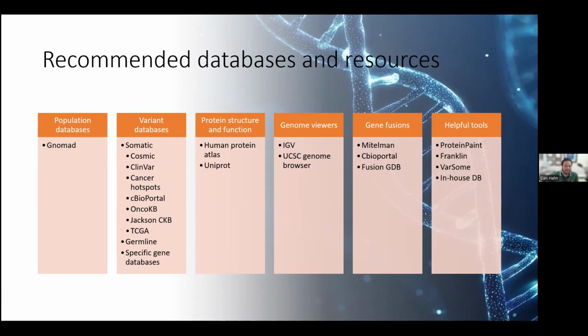Very importantly, we need to confirm the annotation. So using genomic coordinates is usually the best way to confirm that you're looking at the same variant that you're seeing. You want to assess the quality of the provided genomic data based on the source from publications or another database, the number of a specific entry, is it single or multiple, the depth of the study, did they use appropriate controls, did they confirm that it was a somatic variant, or is it potentially germline?